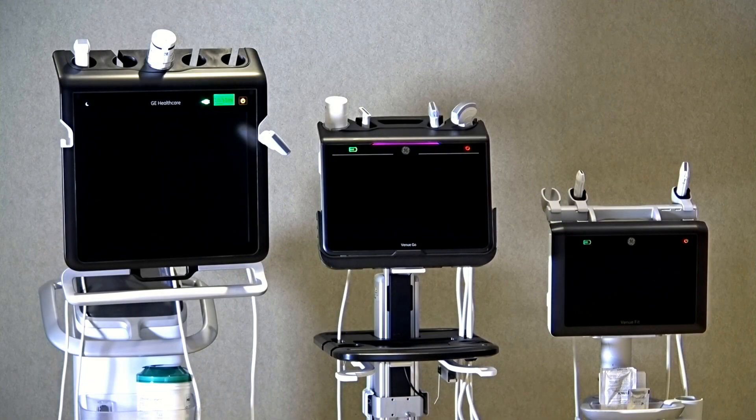As you can see from the displayed transducers, there is a large assortment of ultrasound probes available for the Venue family systems. These are interchangeable between the systems, and can be further detailed in our transducer guide at GEHealthcare.com.